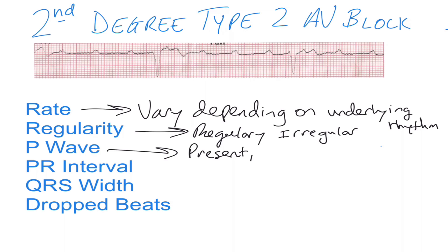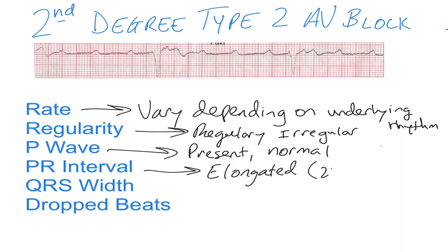P waves are going to be present and normal, but the PR interval is going to be elongated — greater than one large box, or 0.2 seconds. However, there is usually a 2-to-1, 3-to-1, sometimes 4-to-1 conduction ratio of P waves to QRS complexes.